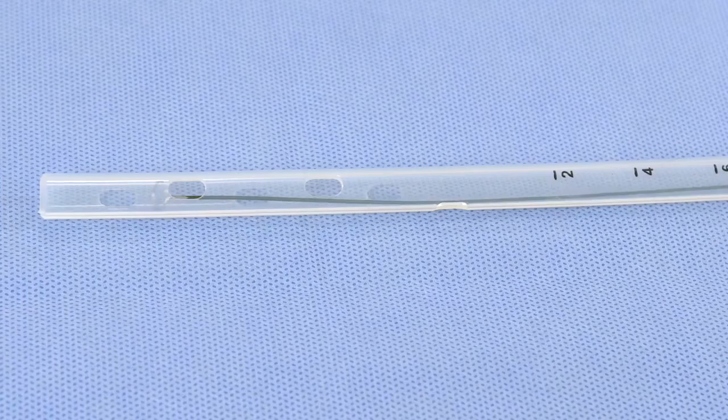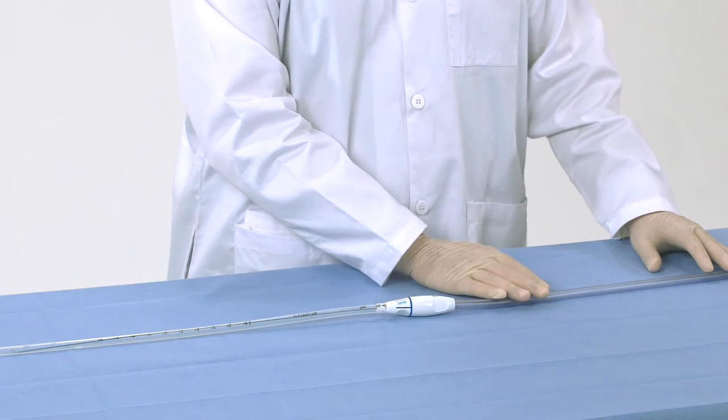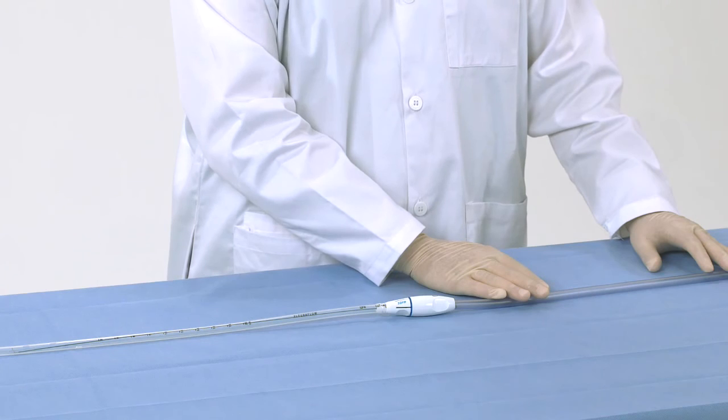In summary, seeing clot on the clearance loop and wire is normal. When needed, you can employ these maneuvers to help break it up. More frequent actuation may help minimize this issue. In rare circumstances, this may require replacing the clearance apparatus, so you can start with a fresh clearance wire and loop while leaving the existing chest tube in place.